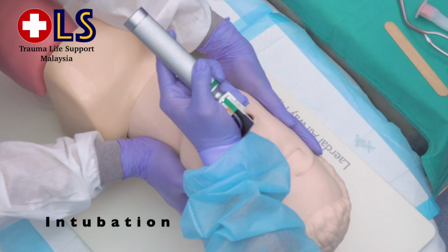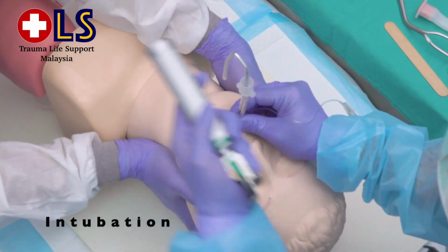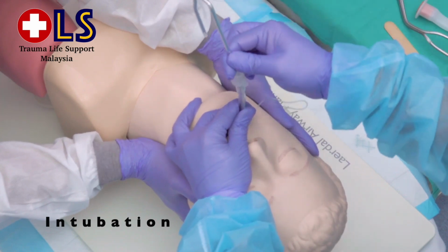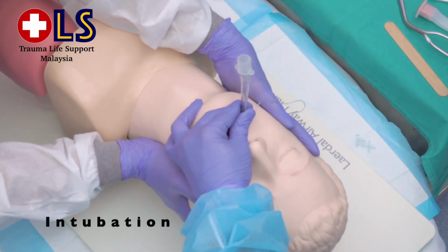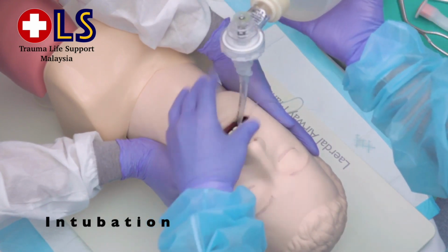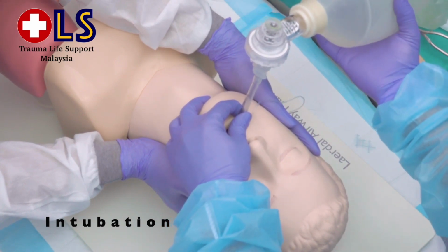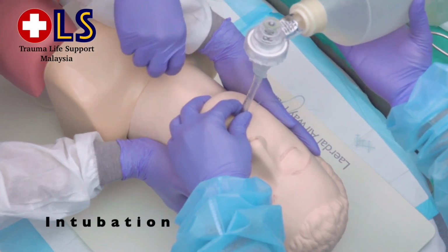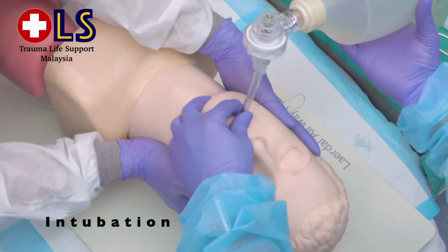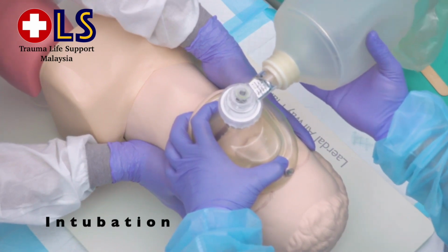ETT. Remove your stylet. Auscultate for air entry. In situations when there is difficulty in intubating, we would require a bougie.